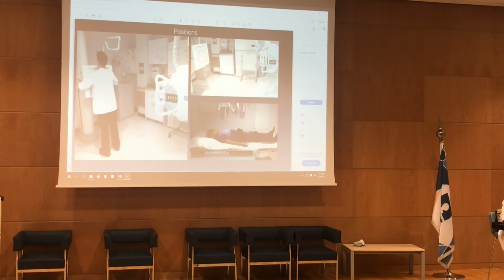Okay, if the patient is doing the X-ray in the anteroposterior, this means that the X-ray beams will hit the patient through the front and get out from his back. So his back is the one closer to the detector or the screen film. Okay, and this is important. We'll explain why later, because it changes how you look at things.